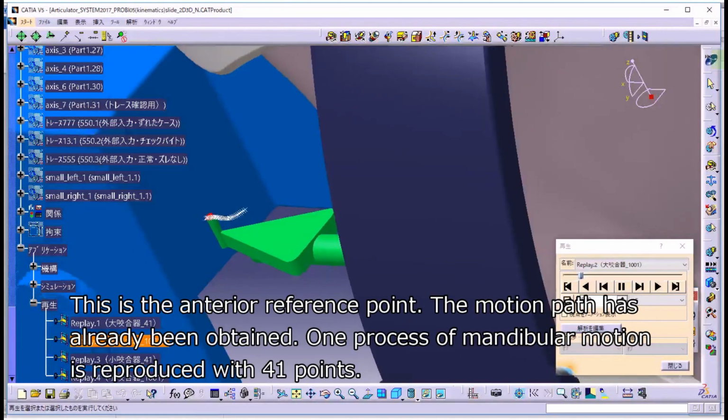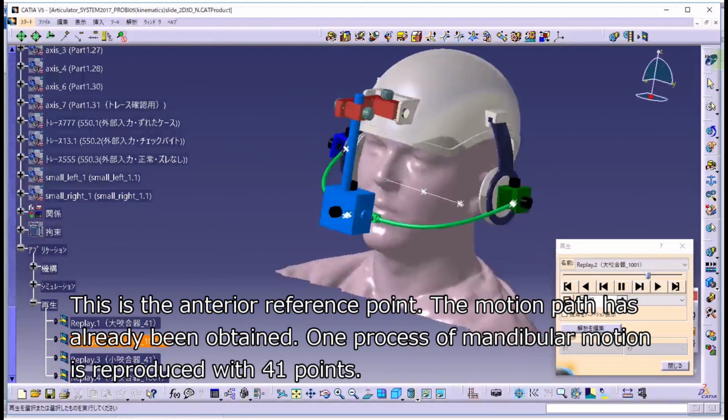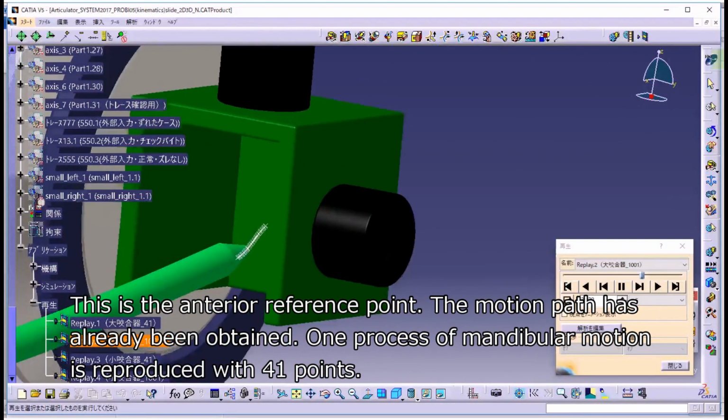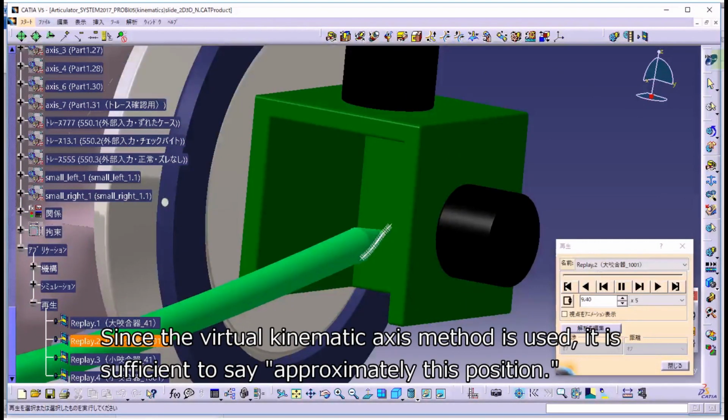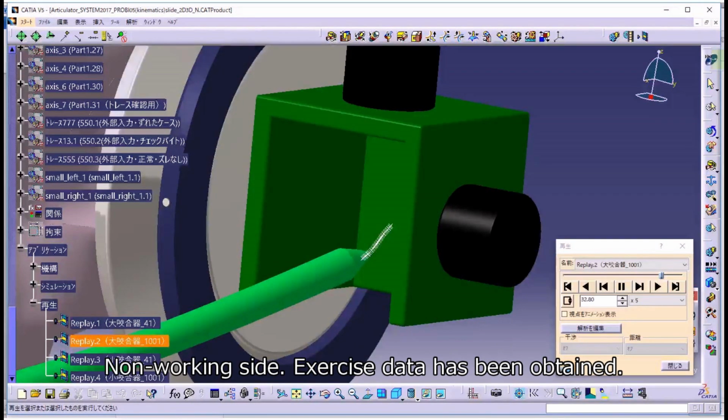This is the anterior reference point. The motion path has already been obtained. One process of mandibular motion is reproduced with 41 points. Since the virtual kinematic axis method is used, it is sufficient to say, approximately this position. Non-working side. Exercise data has been obtained.